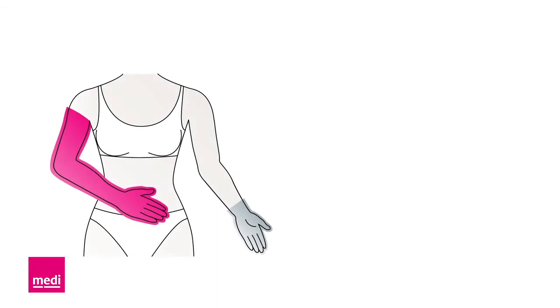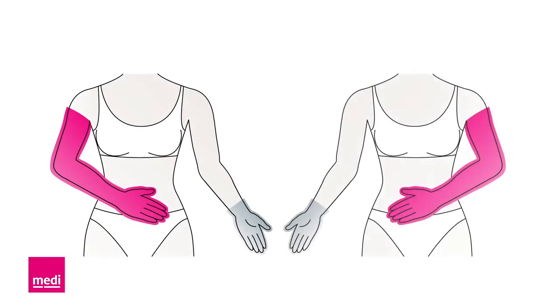The rest of the donning process is much easier with rubber gloves. Wear the rubber glove on your left hand if you want to wear the arm sleeve on your right arm, and wear the rubber glove on your right hand when putting the arm sleeve on your left arm.